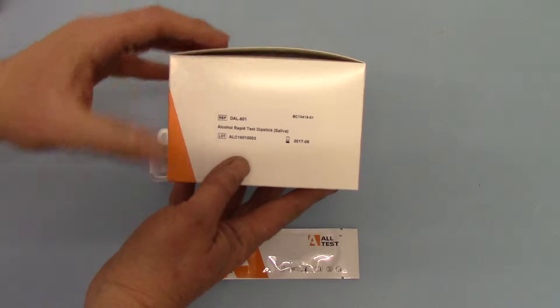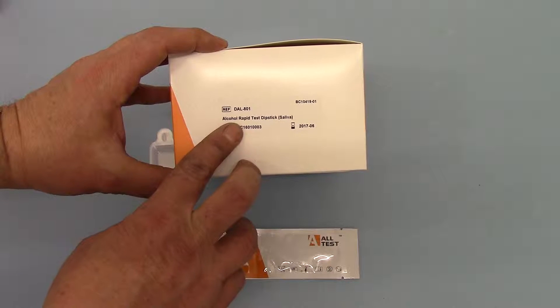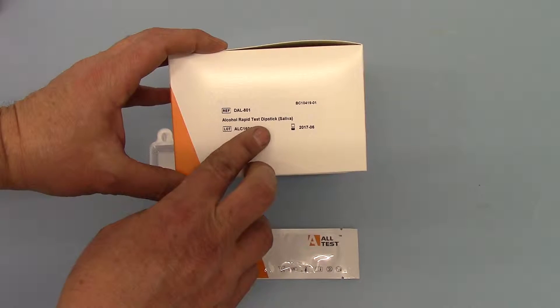If we just rotate round to the end panel, you can see the code for this is DAL801. This is an alcohol rapid test dipstick for saliva.